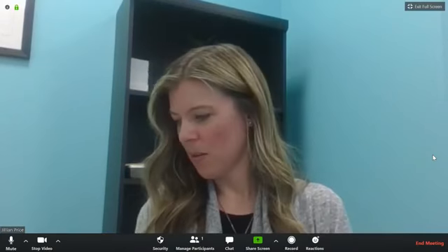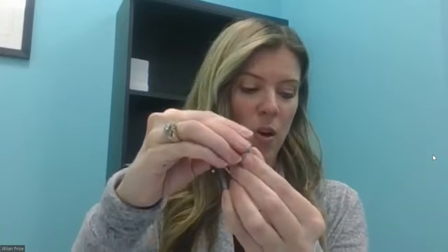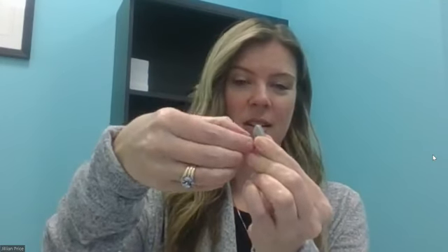So let me show you. I lost the hearing aid. Where did you go? So we'll just use this one. Oh, there it is. Okay. So I'm going to open the battery door, flip it upside down, remove it, leave the battery door open, and put it right on top. There you go. Then I'm going to close the lid tightly, and it's going to stay in here all night.